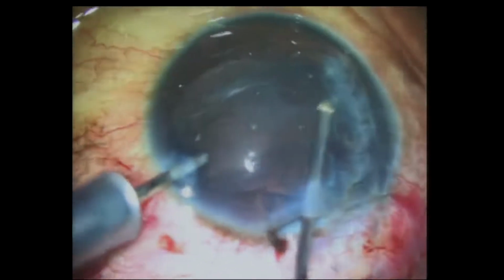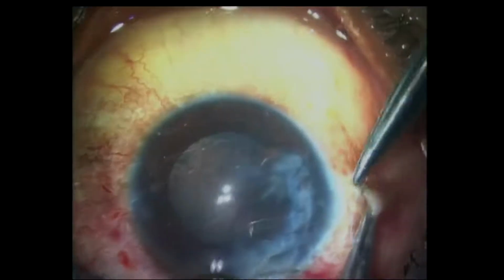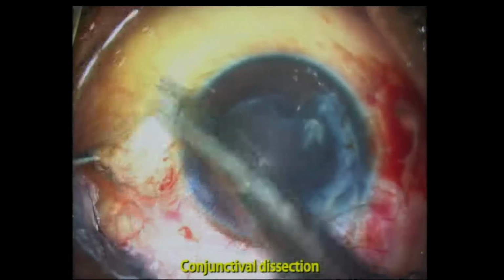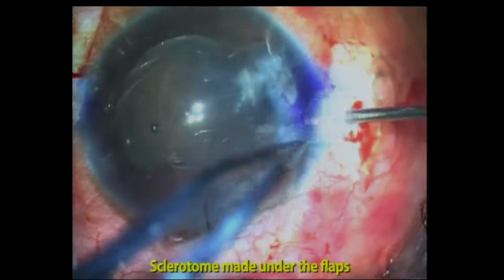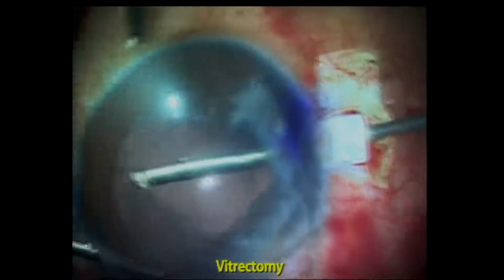So I had to actually cut it with a vitrector. Upon cutting it with the vitrector, I did notice that there was some amount of vitreous coming through. And once I found vitreous, I don't like to place anything, especially if my anterior rim is not intact. If my anterior rim is not intact, I cannot place it in the sulcus. I cannot go ahead with the surgery because vitreous at some point is going to come on top.